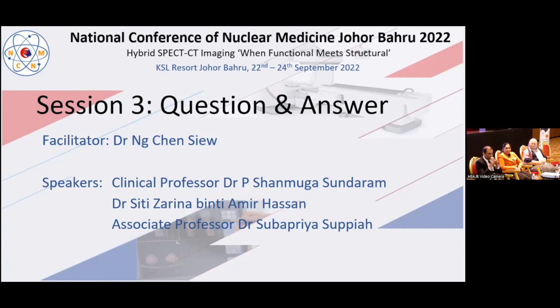I think I answered that question. I will repeat it. So if you know by the planar scan already that there is some uptake, and you want to localize it correctly, then do a single phase SPECT-CT to save time as a delayed scan. Delayed here we mean by 1 hour. After 1 hour, you do only one SPECT-CT. If you have already seen some uptake in the initial image, and your intuition is that it is most probably going to be positive, then you can do that.